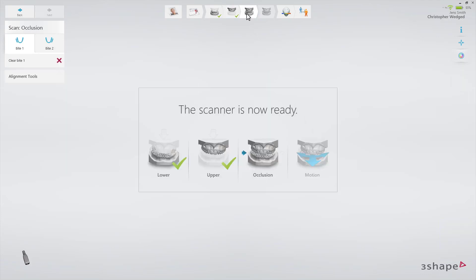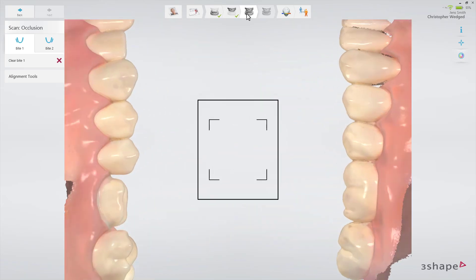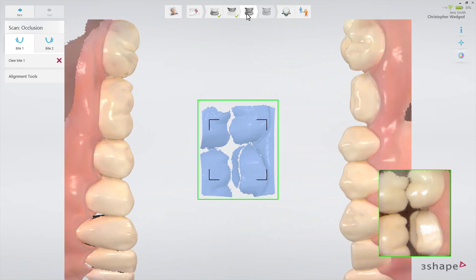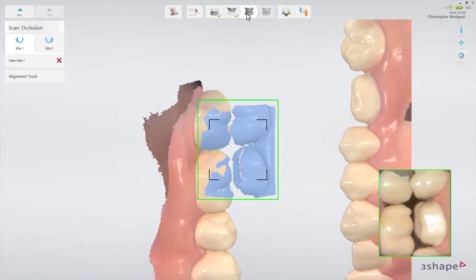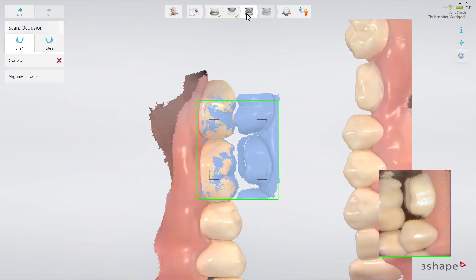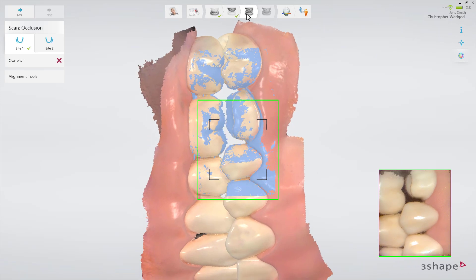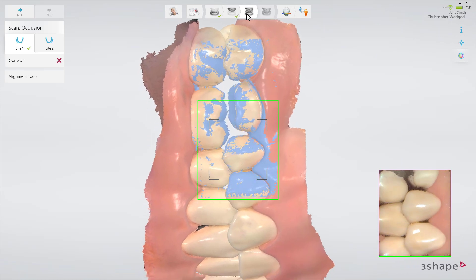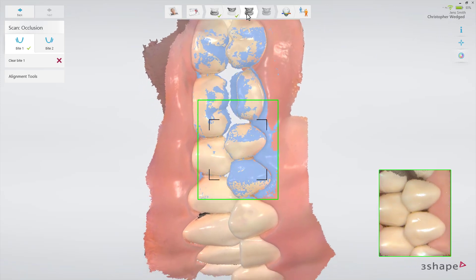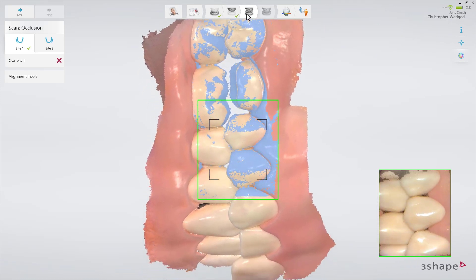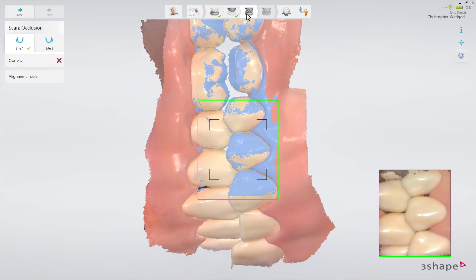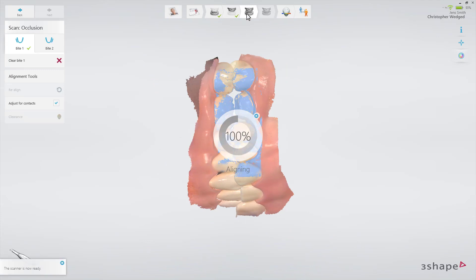Now move to the bite scan page. Insert the scan tip to the second molar on the buccal side. Ask the patient to bite. Scan three to four teeth until the upper and lower arches snap to the bite scan. The light blue surface indicates the surface covered by the bite scan.